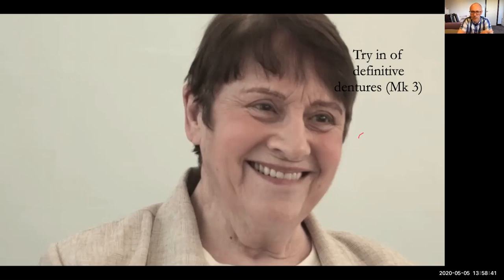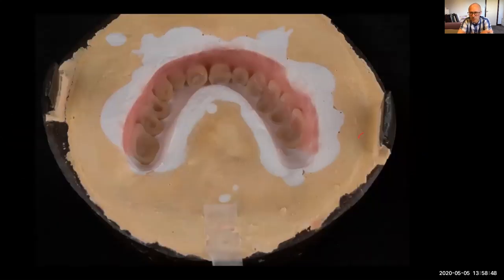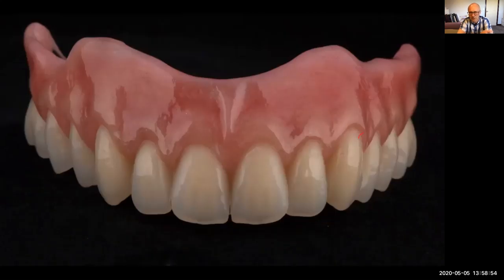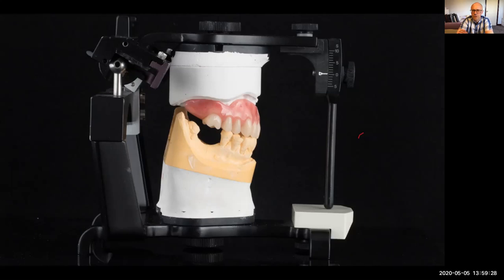And she was really happy with that. So Rowan beautifully finishes everything, flasks and packs, does the gingival colouring, makes it look really superb, and then finishes the denture. We've got 2 of these identical, but this shows it from the side here. And this is why in Olive's case, there's no way I could actually put a fixed bridge in the top there. To actually support the lip properly, we've got to have a proper flange on that there. And there's no way we could do something that was fixed and that is cleansable. Very, very important.